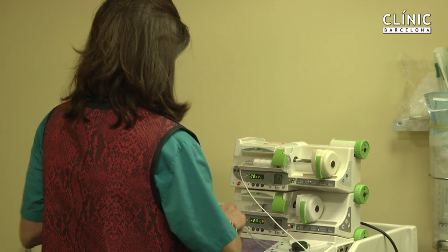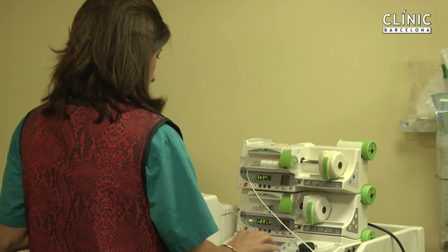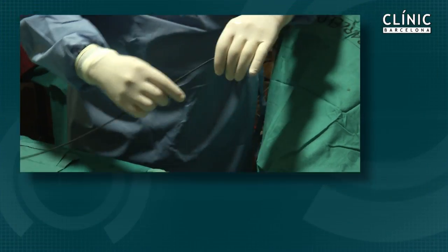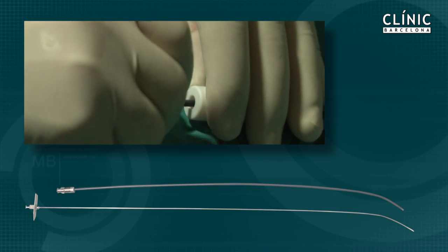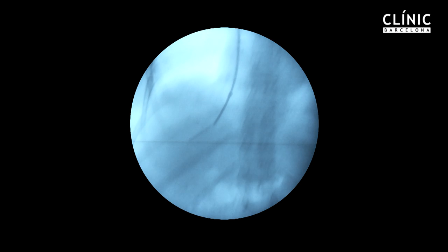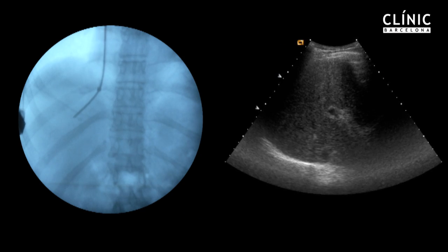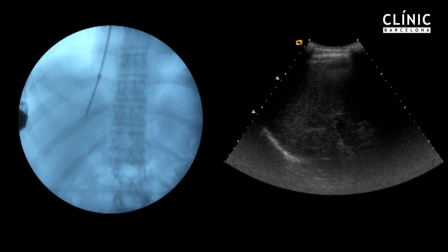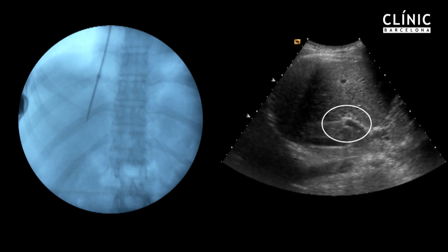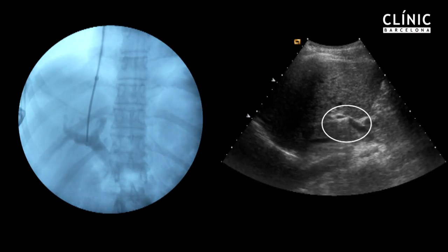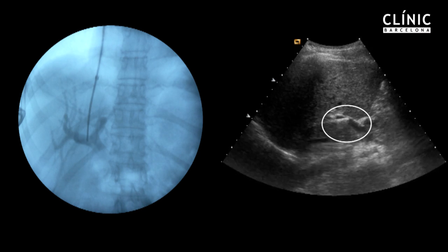Deep sedation and analgesia are achieved with intravenous propofol and remifentanil, after which the catheter and puncture needle are advanced into the liver. Real-time ultrasonography is extremely helpful in guiding portal vein access, allowing us to check whether the catheterized hepatic vein is the most appropriate to access the portal vein and to follow the direction of the needle through the hepatic parenchyma.